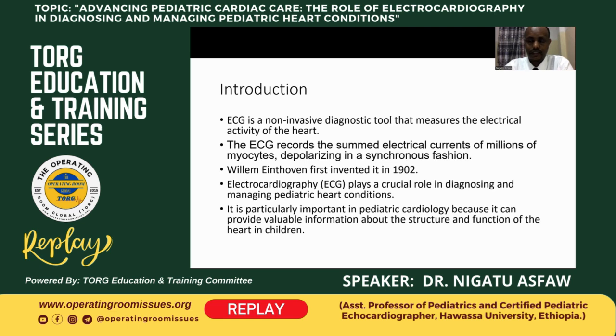ECG is very important in diagnosing as well as managing heart conditions in pediatrics. As it is easily available everywhere, compared with other diagnostic cardiac tools like echocardiography, ECG can be used by nurses or other clinicians to get a first insight into cardiac problems in children.